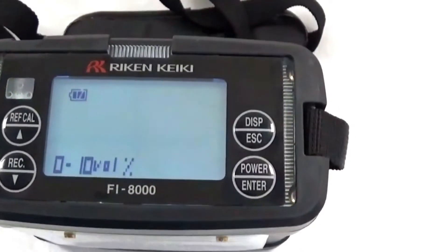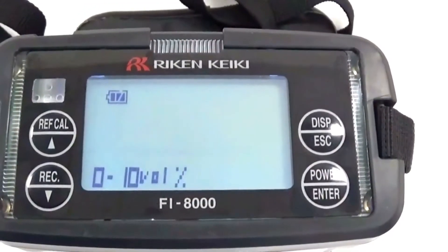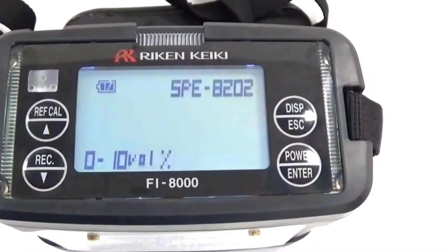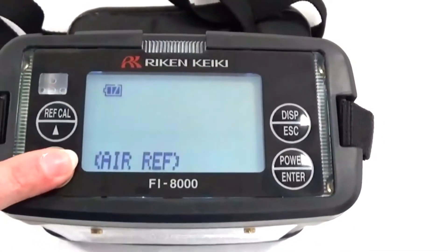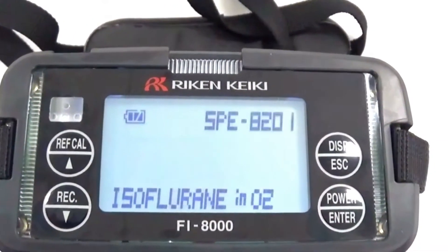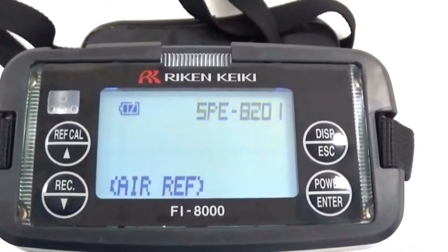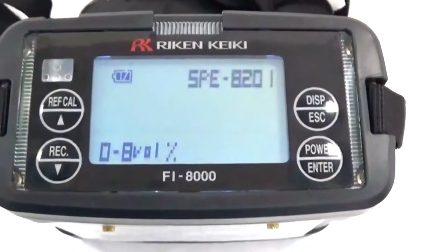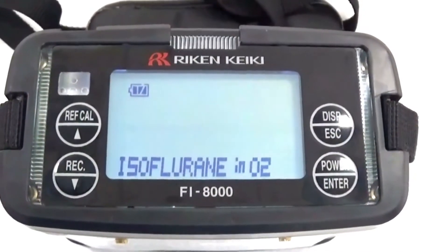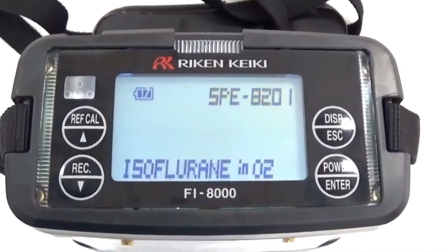Notice the SPE at the top of the screen is flashing, and we are in SEVO and O2. We want to be in isoflurane. We will arrow down and now isoflurane and O2 appear. Notice the isoflurane is the agent we will be verifying and O2 is the carrier gas. In order to get to a different anesthetic agent, it will be necessary to arrow up until you get to the anesthetic agent and carrier gas being verified. We will now hit enter.